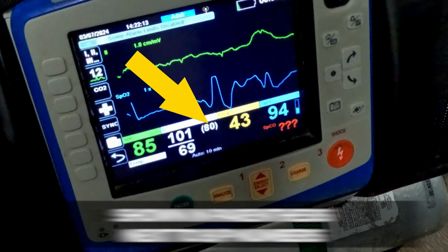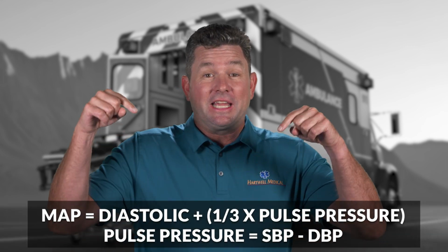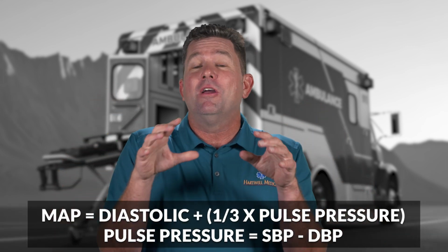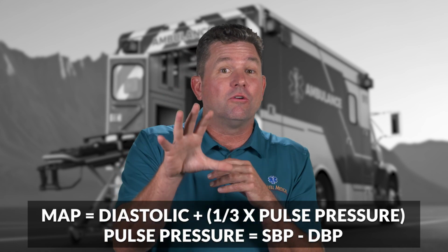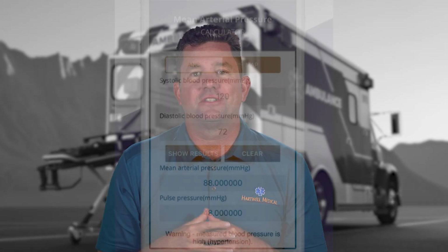It's right here. So if you're taking a manual blood pressure, you can still calculate it. You can get a very simple app for your phone that'll calculate it for you automatically. And yes, you can even calculate it all on your own using this equation right here, but you're not going to remember it, nor should you. Just get an app because that's way easier to do.